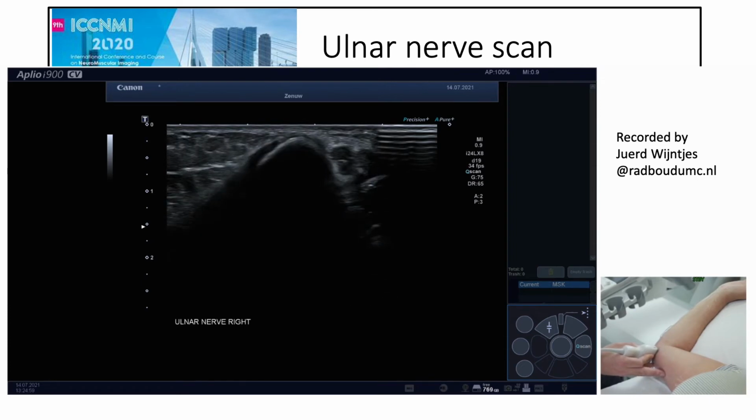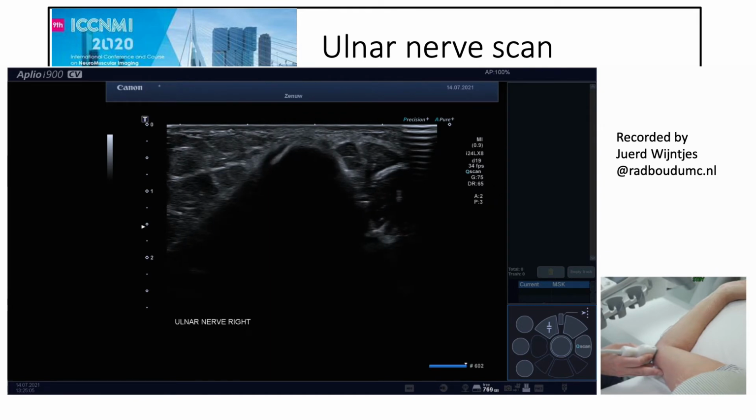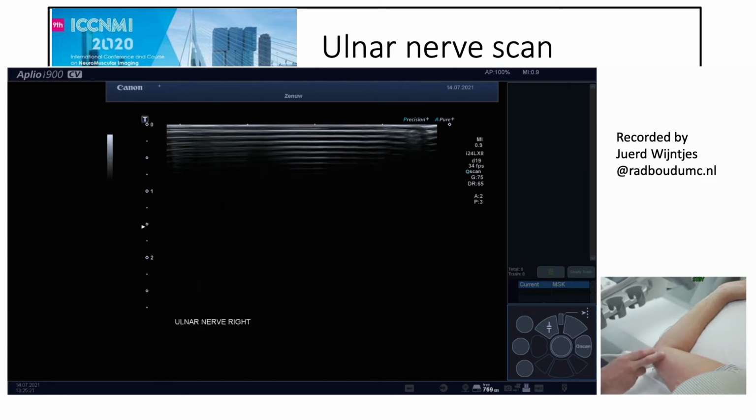Now it's here, you see on the right side of the medial epicondyle the ulnar nerve, and we said that this is one of the most common positions of external compression. And you can see how inaccurate this ellipse technique actually is, but as said, it is very fast.